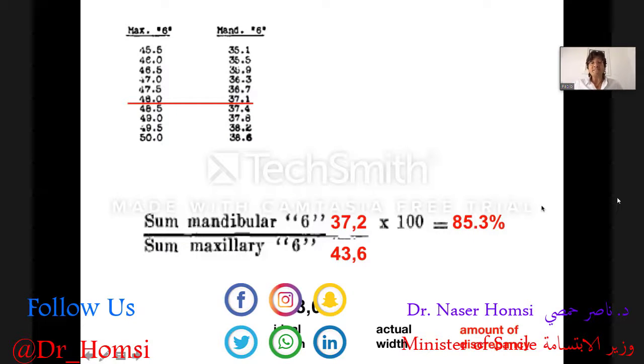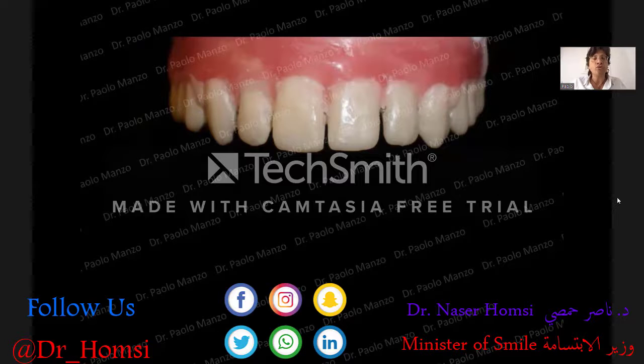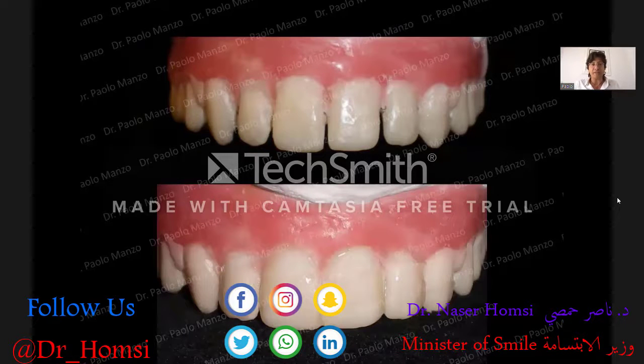And I want to tell you, as the difference between ideal width and actual width is like 4.4, it means we should manage the second step with an aesthetic phase. With this patient, at that time, I didn't use a digital workflow, but I used an analogic workflow, and my lab mounted the resin teeth on a piece of wire passing through the crowns like this, and we can move the crowns on the first order, so the horizontal plane. And once we decide that the position of the teeth is okay, we can add some resin to the resin of the teeth, and we can transform it into something like this.